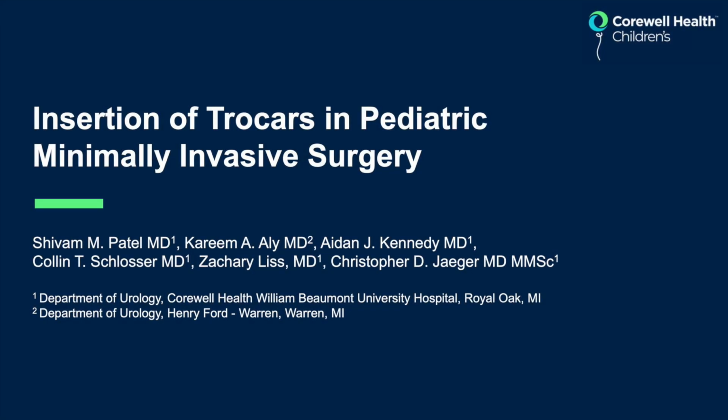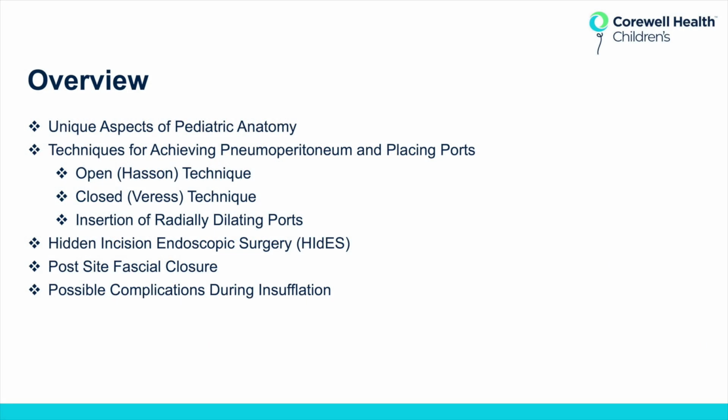Since the initial use of laparoscopy in the management of non-palpable testes in the 1990s, the use of laparoscopic and robotic surgery in pediatric urology has expanded significantly. This video will cover the proper technique for and other unique aspects of port placement for minimally invasive surgery in pediatric patients. This video will review unique aspects of pediatric anatomy relevant to port placement.